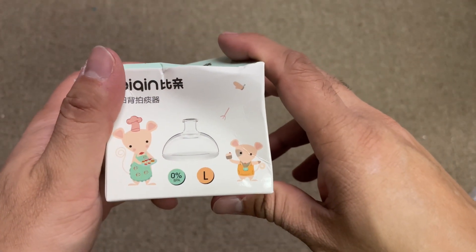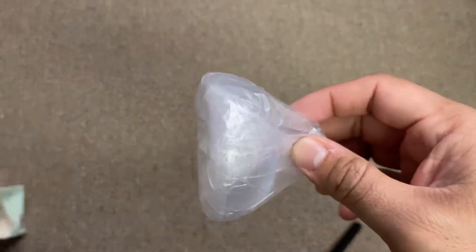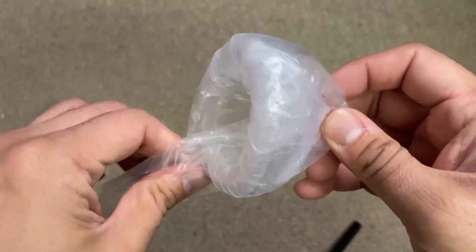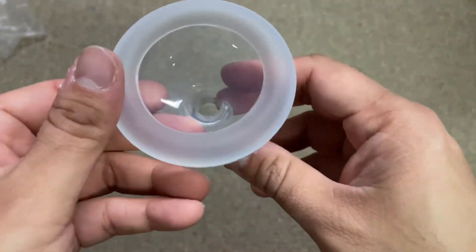Hey guys, this is the Fenwar palm chest percussion cup. This cup is actually used on the chest as a phlegm remover. You can just put it on the chest — it has a soft corner.